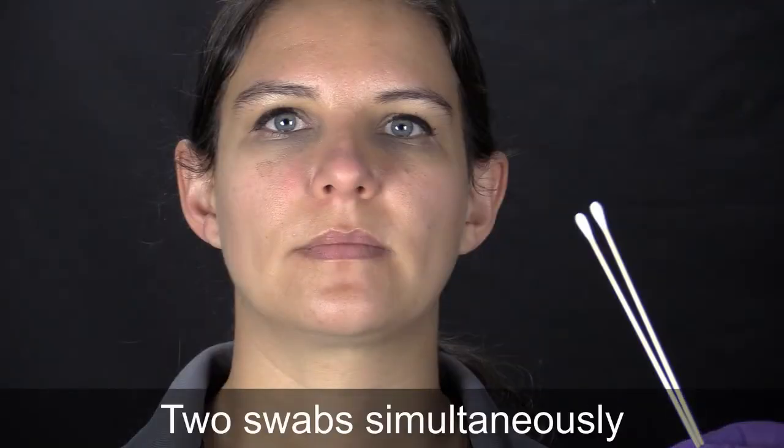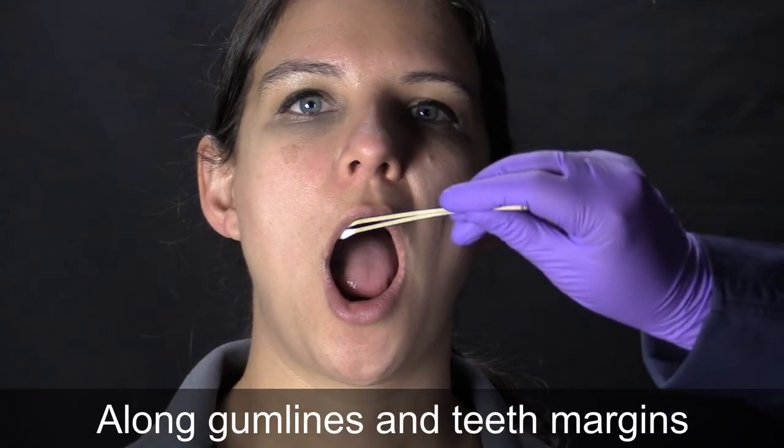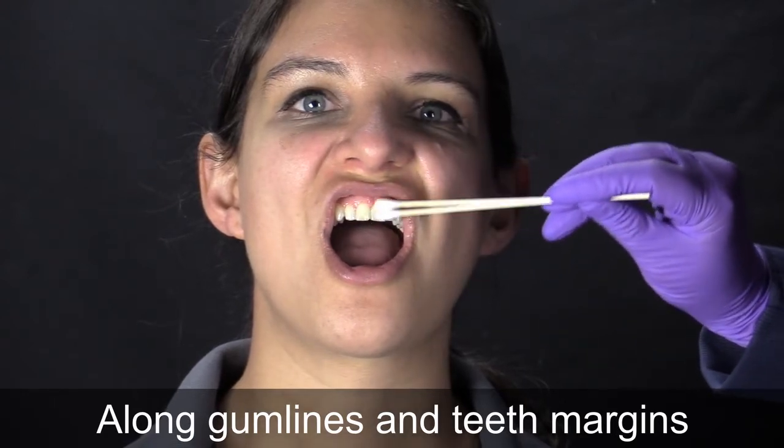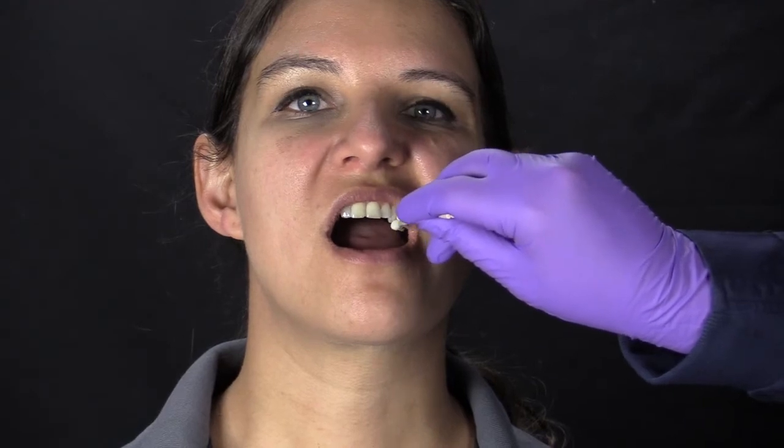2 swabs are collected simultaneously. This is done by rubbing the swabs along the teeth and gum lines. These are areas where semen may be trapped in the mouth, much like the same areas or locations where food may be expected to be caught or trapped.